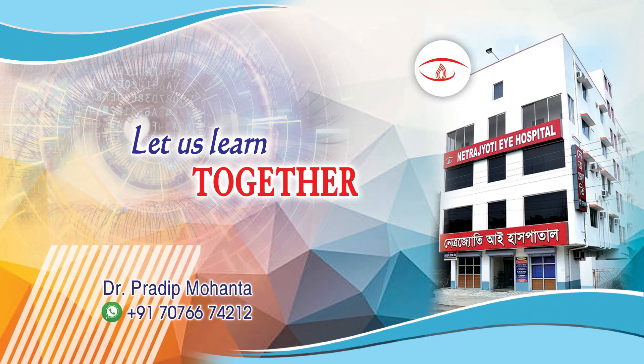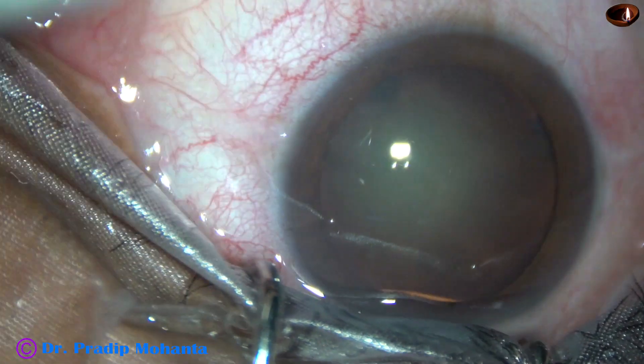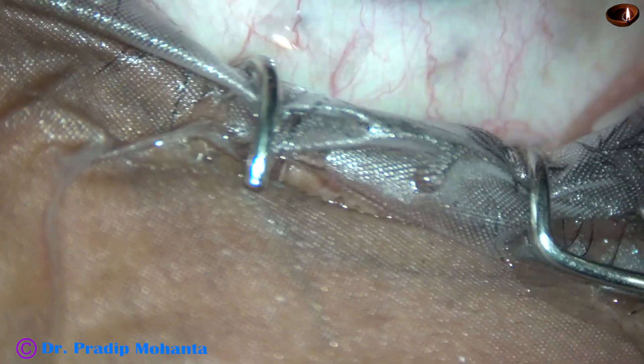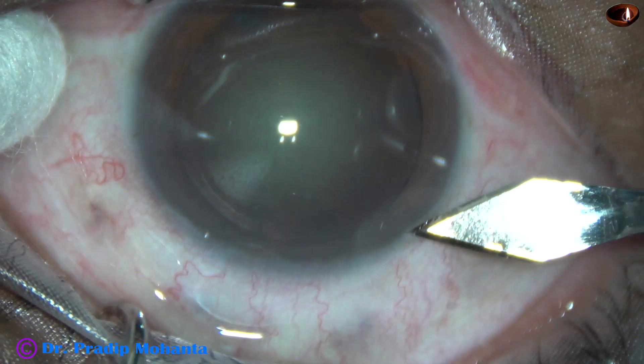Friends, welcome to my workplace at Pranakhart, West Bengal, India. This is a cataract with grade 3 nuclear sclerosis. In this case, I want to demonstrate the stop and chop technique of phacoemulsification.